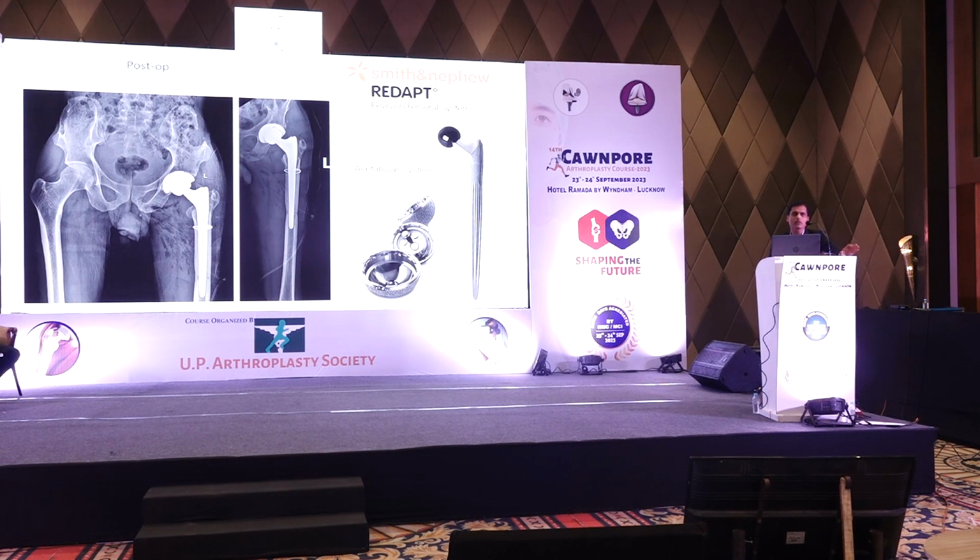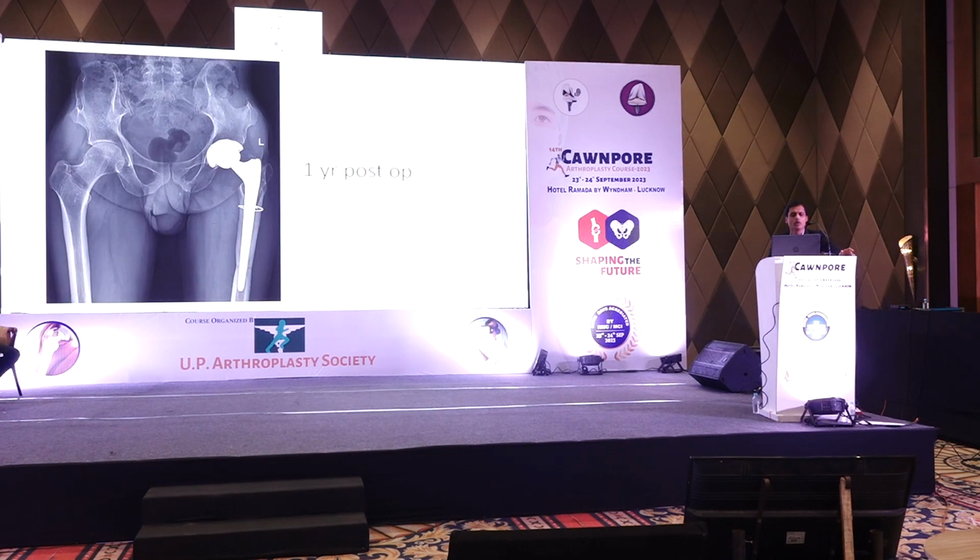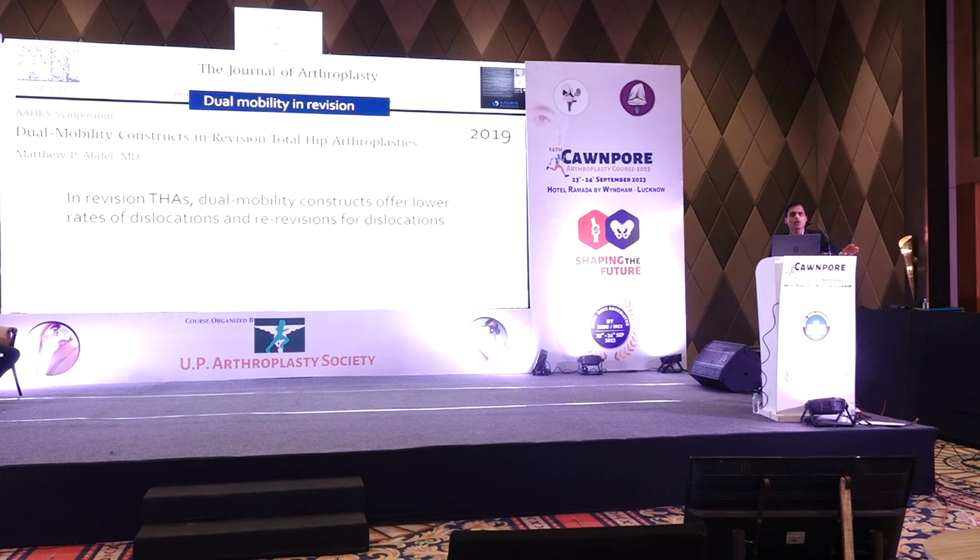But the key point here is when to intervene. In a proximal femur fracture, whenever it goes for failure, try to intervene early. Don't wait for more complex situations to arise. So the most important thing is a distal loading uncemented stem. Whether dual mobility is needed, not always is a dual mobility needed. Assess the abductors. Most of the time you will be able to get away with the regular uncemented distal loading stem.